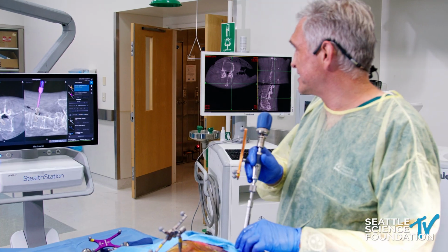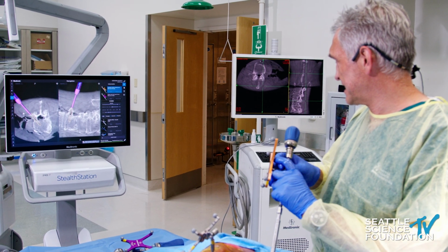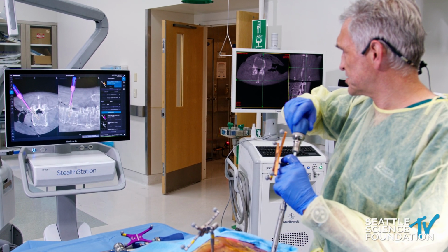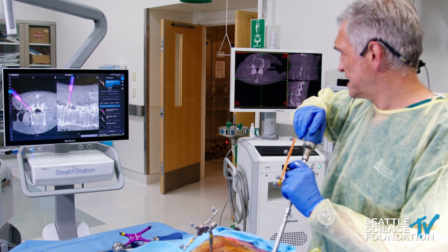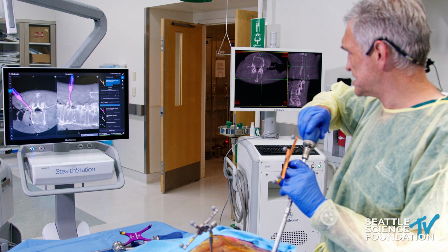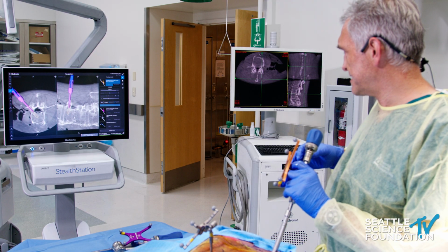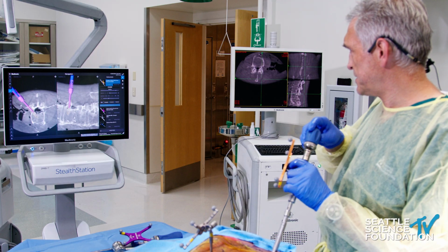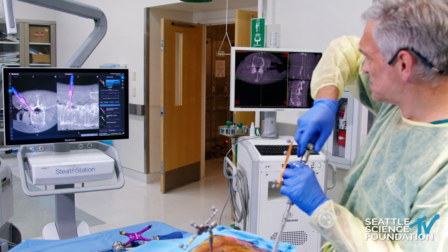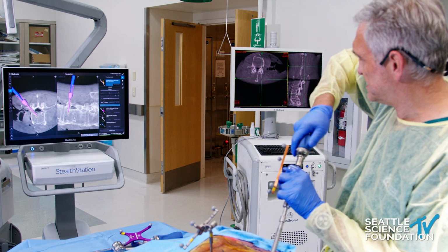So now we have that pedicle screw simulated here, and again I put in the screw and follow that trajectory with the screw. And then every once in a while, you let go a little bit to see where the screw really is, because as you're moving things up and down, right and left, you can let go to get a better sense where the implant really is. But this all looks pretty good. And then obviously you get the tactile feedback. So this feels really good.